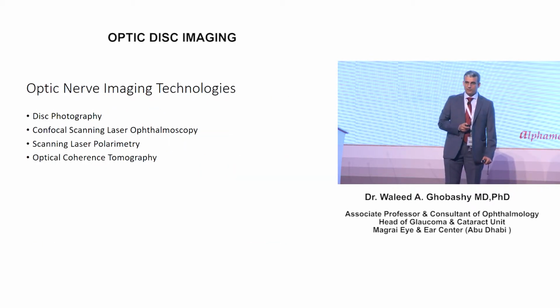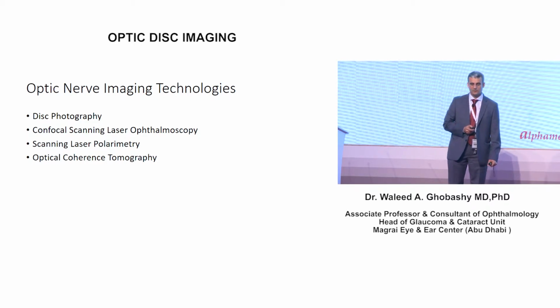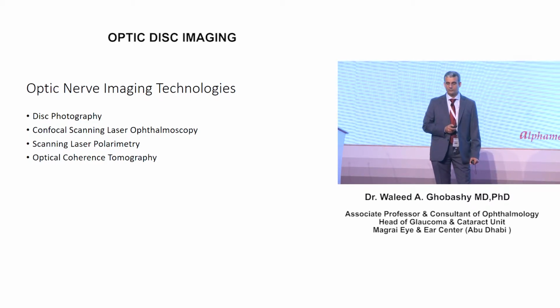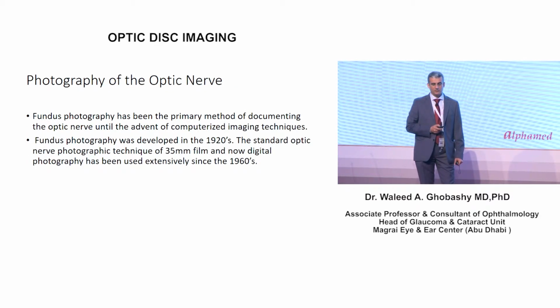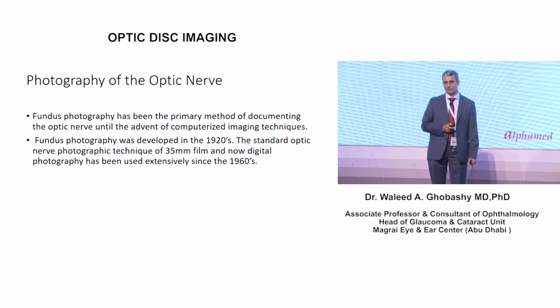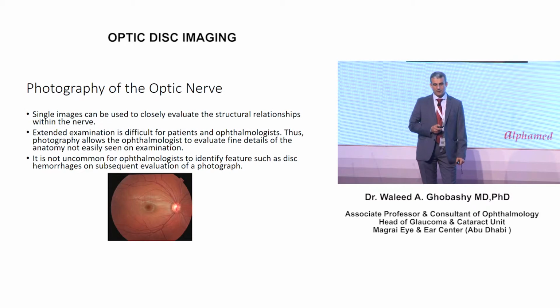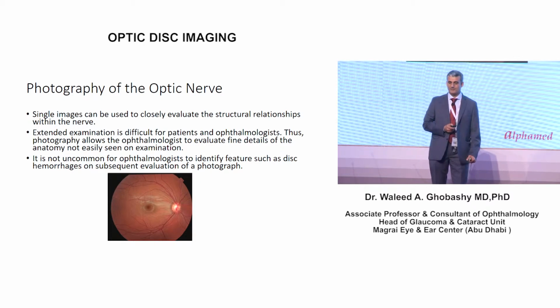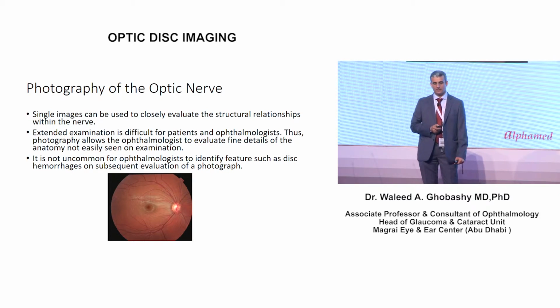We now have almost four common technologies for evaluation of the optic disc, including disc photography, confocal scanning laser ophthalmoscopy, scanning laser polarimetry, and finally the widely used optical coherence tomography. Starting with photography of the optic nerve, fundus photography has been primarily the method used by all ophthalmologists, started in the 20s of last century and extensively used since the 60s. A single image can be used to closely evaluate the structural relationships, and it allows extended examination in a more convenient way for both the patient and the clinician.